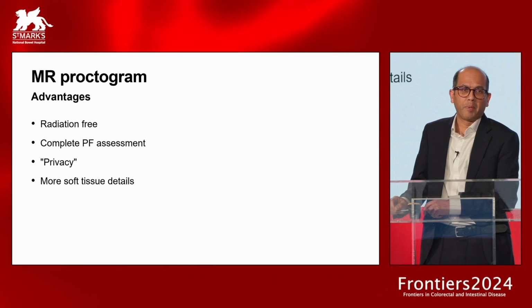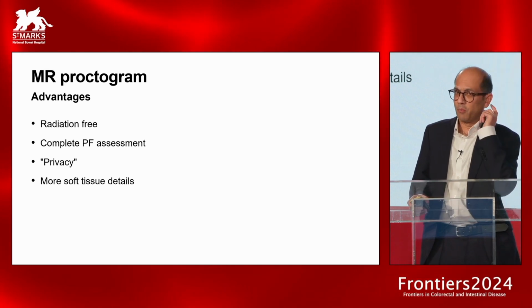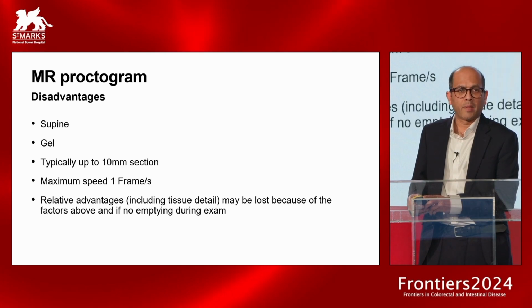Some people do prefer the relative privacy of the MR suite, but that depends on individuals. And there is the potential to have more soft tissue detail, not just in the different compartments, but sometimes more soft tissue detail generally.